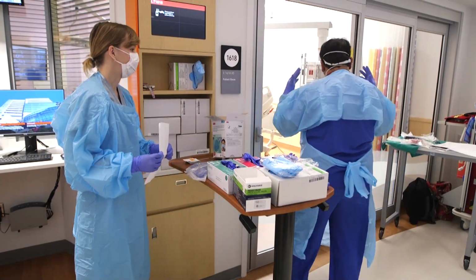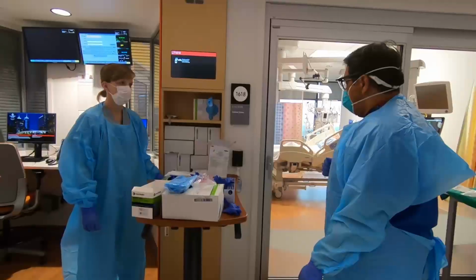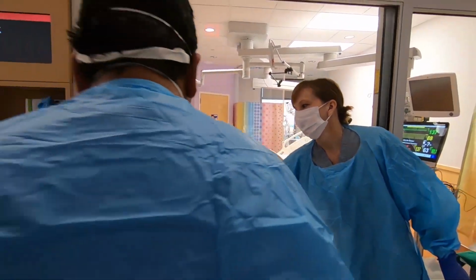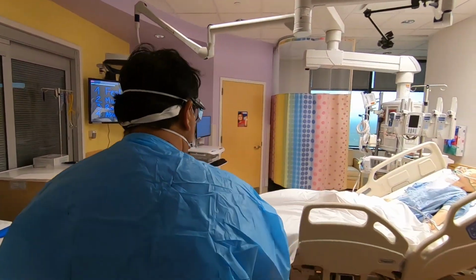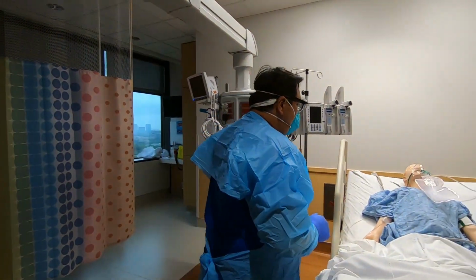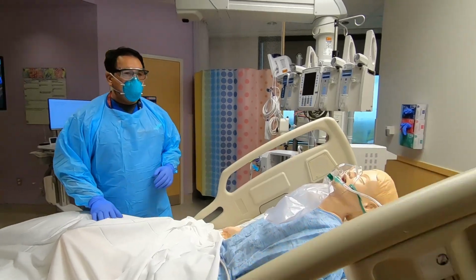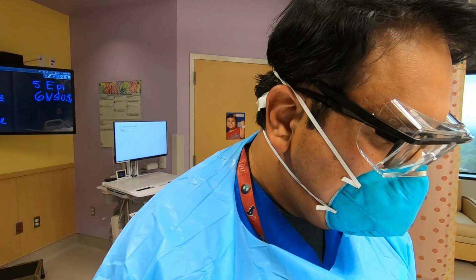This video will discuss key principles for intubation of a COVID-19 person under investigation or positive patient at Texas Children's Hospital. We are going to focus on key principles related to intubation specific for COVID-19 patients. We know that all of you are experts at intubation, and we will focus this video on things that are different or unique aspects related to COVID-19 patients.